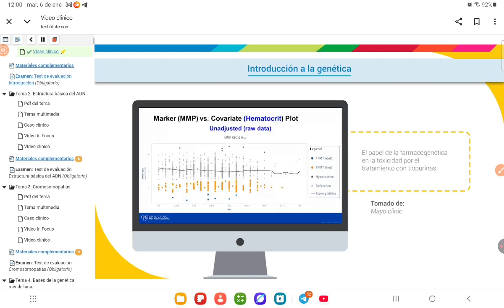Finally, another continuous covariate that could be factored in is the hematocrit. The value of adding a second continuous covariate could be found once sufficient data becomes available, in the opportunity of creating tridimensional reference ranges, like the example shown here. This plot shows the median orange plane plus minus 1 and 2 standard deviations of the amino acid phenylalanine in dried blood spots, adjusted simultaneously for two continuous covariates, age of collection and birth weight. The count of data points exceeds 1.2 million.